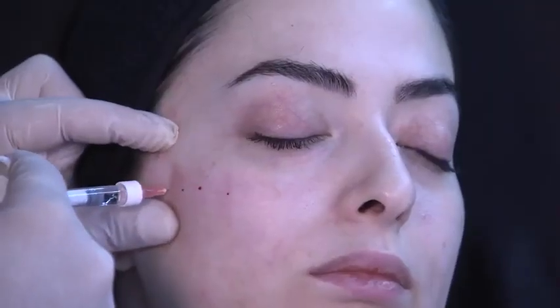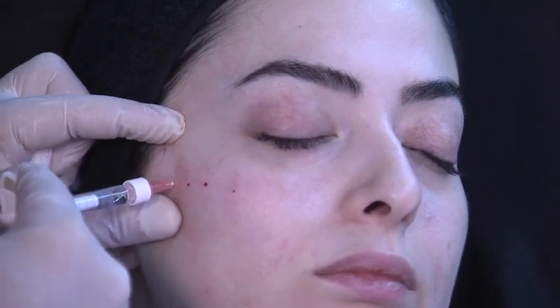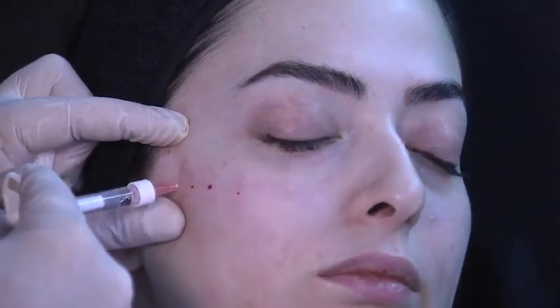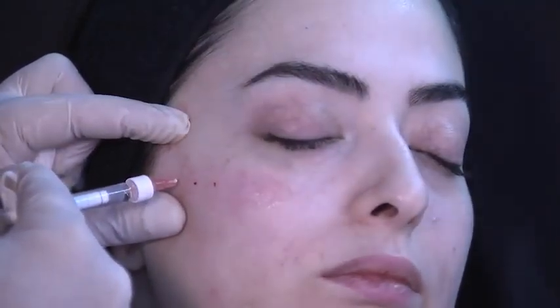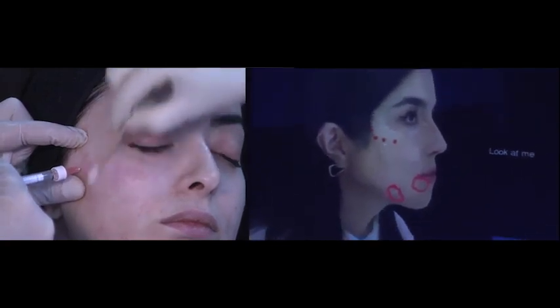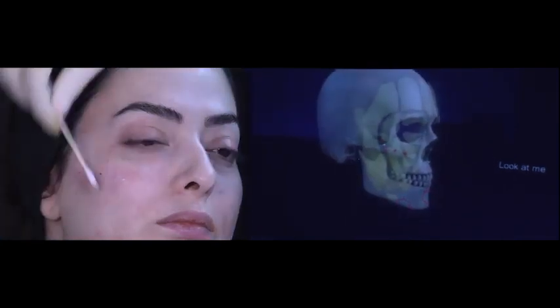So every 1 centimeter or 1.5, I'm going on bone, and I start my bolus, and look how my needle goes out. I still infiltrate, and I stop before I leave the skin. You can forget the last one, but these 3 points are the lifting points on top of the zygoma, which we use as a bar to lift all the way down to the lower third, because we can take off the jowling, and we can also improve the marionette area here.